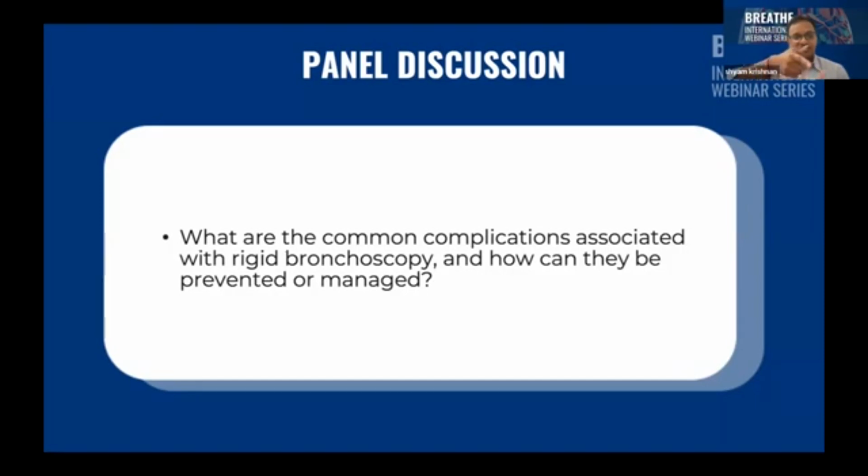So prevent that. Gently try to elevate the head or lift the shoulders a bit, so that you position the axis of the larynx. You can get it down slightly more, and the axis is right onto the scope's axis. And then the other technique is where you slightly turn the bevel end of the scope by 90 degrees and then gently go ahead into the trachea, negotiating the vocal cords. So that is the right technique. If you do this, the major issues are over.